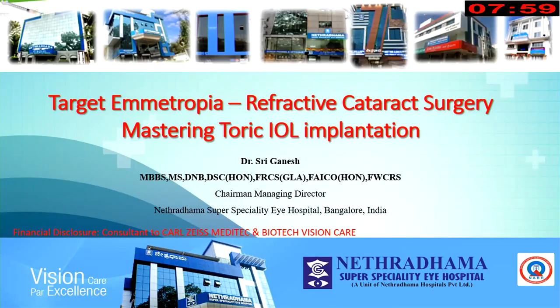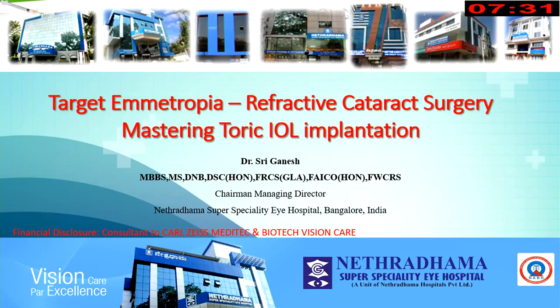Good afternoon, dear friends. To start off, when we look at toric IOLs, the number of toric IOLs being implanted is growing, and in our practice, nearly 50% of patients require a toric implantation. The reason is, if you want to get a good result, you need to have a residual astigmatism of less than half a diopter. Otherwise, the patients are unhappy because the quality of vision deteriorates.